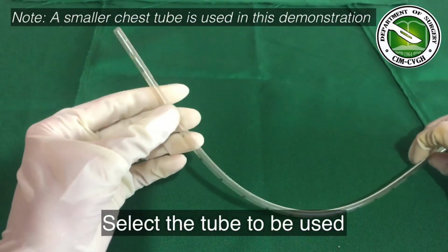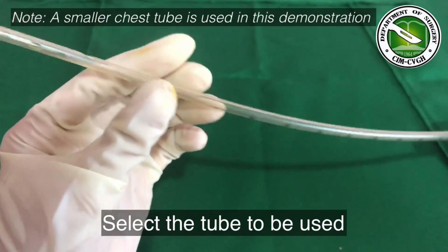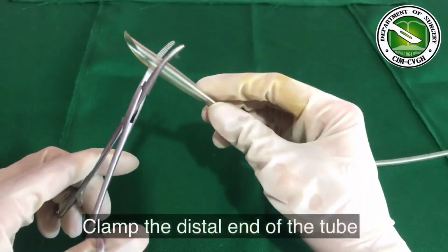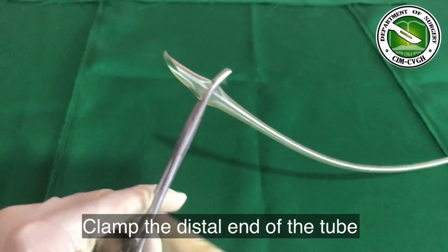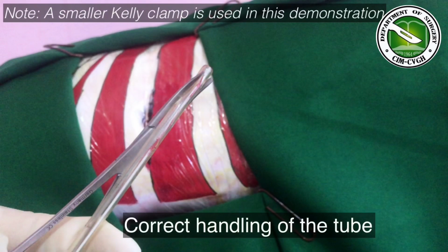Select the tube to be used and note the location of the holes and the distance of the proximal hole to the tip of the catheter. Make sure to clamp the distal end of the tube to avoid making a mess, especially in cases of hemothorax. Grasp the tip of the tube with a long Kelly clamp so that the long axis of the clamp is almost parallel to the long axis of the tube.